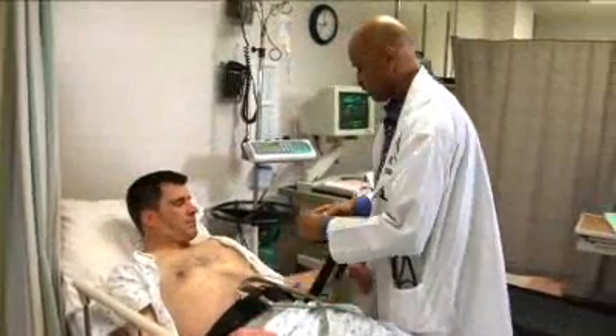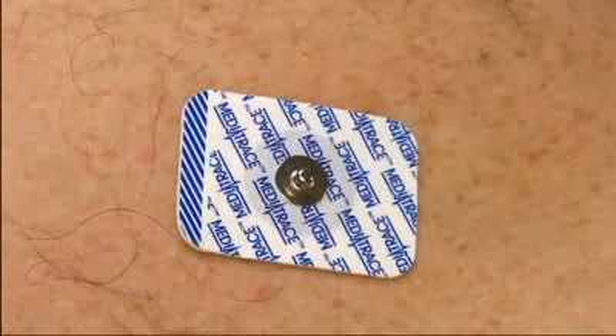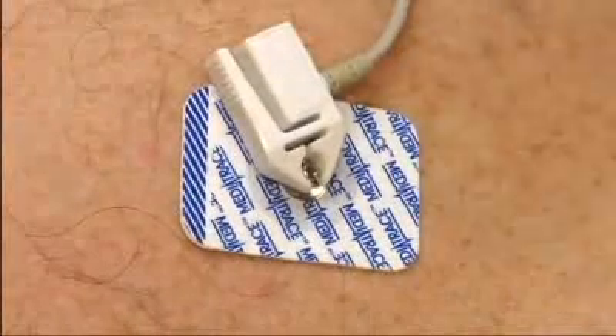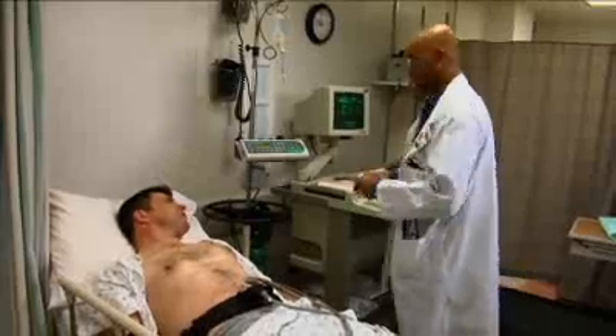After the image session, a specially trained nurse will place electrodes on your chest and wires will be attached to the electrodes so that the electrocardiogram or ECG can be monitored continuously during the test.